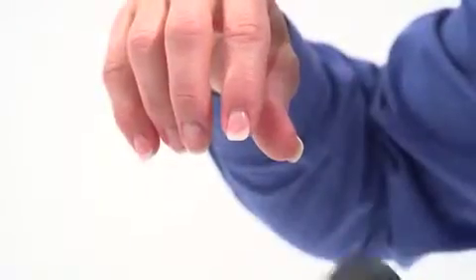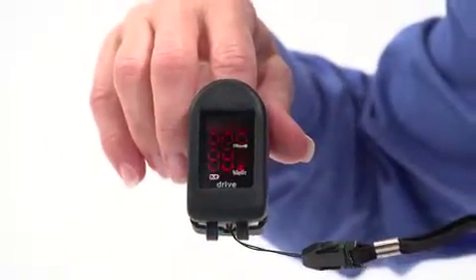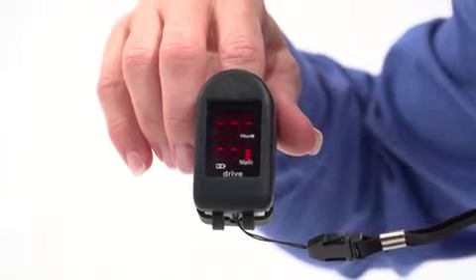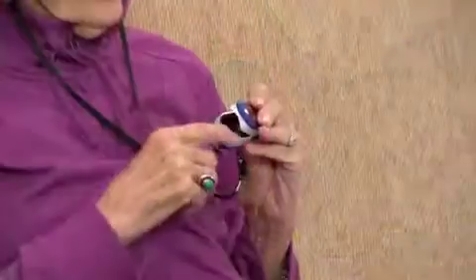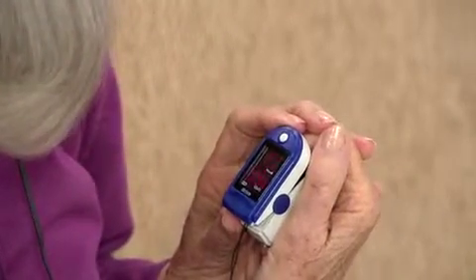The oximeter simply attaches to the user's fingertip, like this. And this large, bright LED display gives instant, accurate feedback so users can clearly see if their pulse rate and oxygen level are at their peak performance levels, or if they need to slow down and rest. It also lets users know when their levels have recovered, and it's safe to continue their activity.